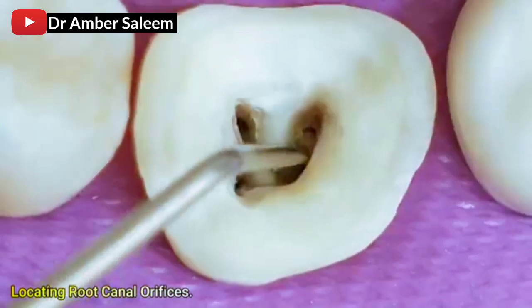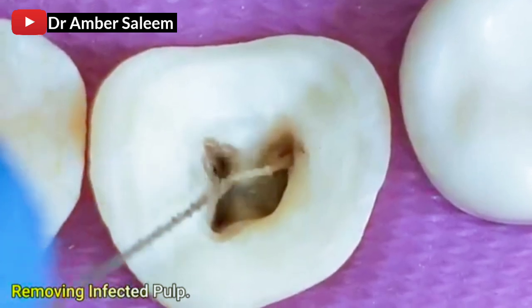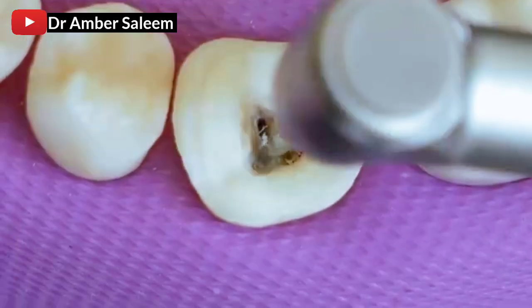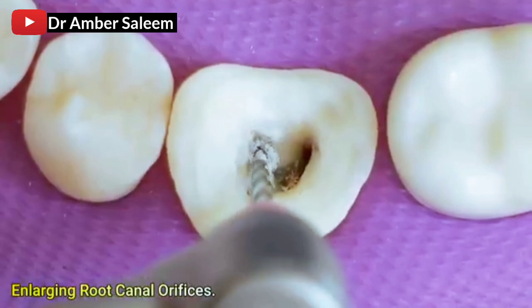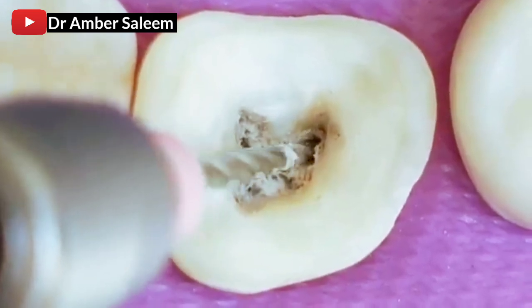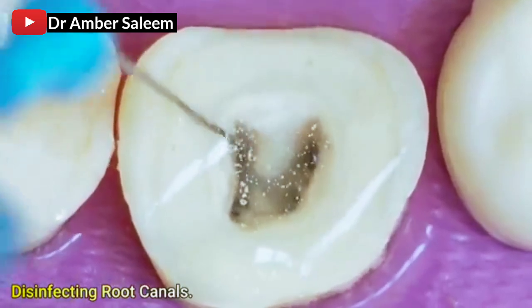Locating root canal orifices. Removing infected pulp. Enlarging root canal orifices. Disinfecting root canals.